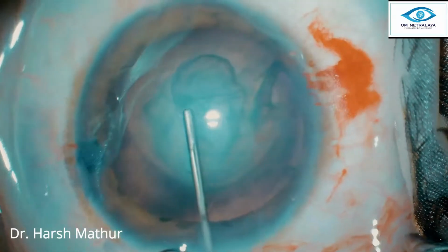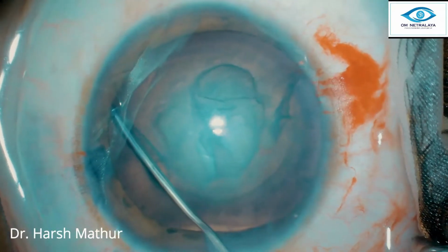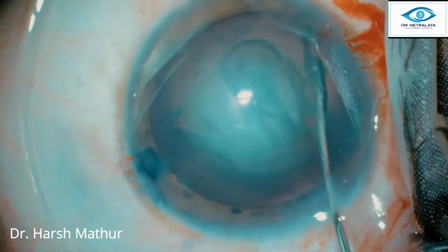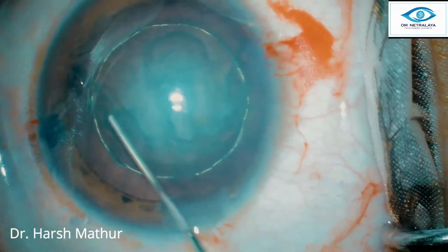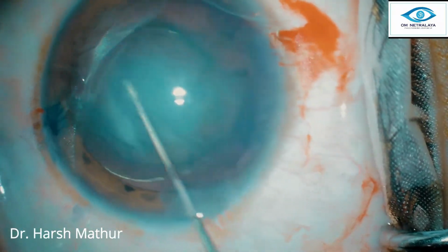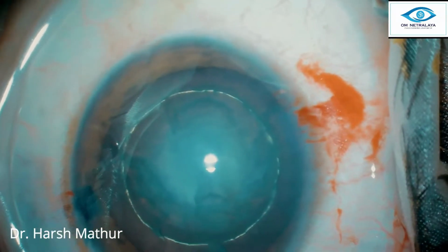A fluid wave goes behind. This can be confirmed by the upward movement of the nucleus, and now is the time to do a hydrodelineation. So we have got a beautiful golden ring. Now, despite continuous hydrodissection, the nucleus did not tilt.